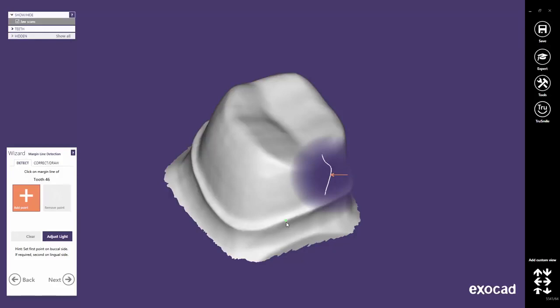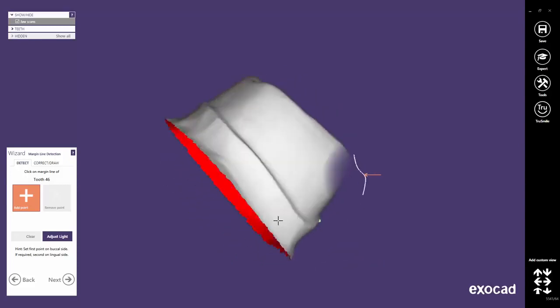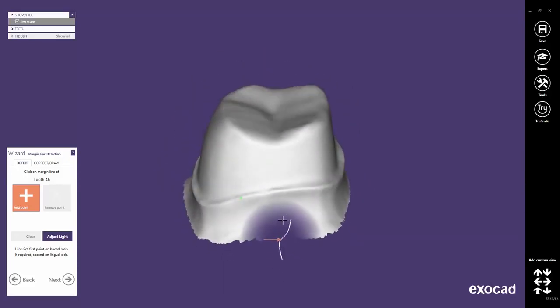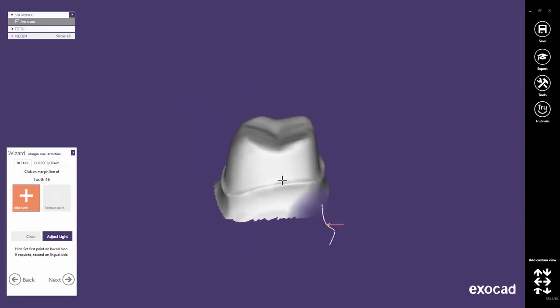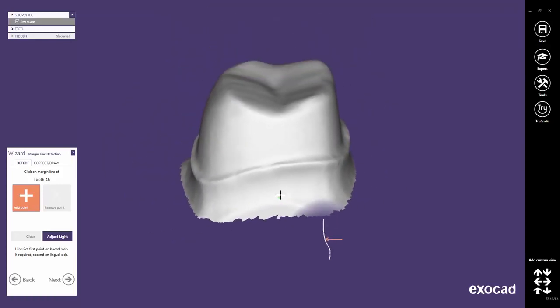You may navigate in 3D space using your mouse. Use the right mouse button, hold and drag, to rotate the view. Use the mouse wheel to zoom in and zoom out. Use both mouse buttons, hold both and drag to pan the view.